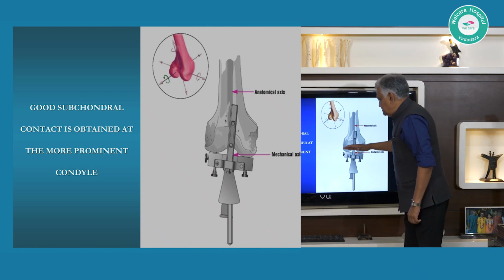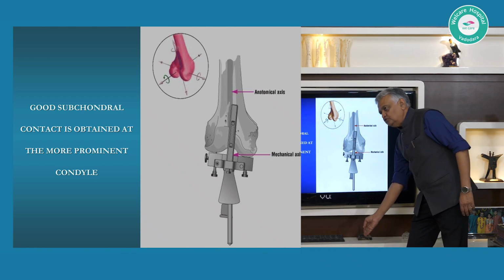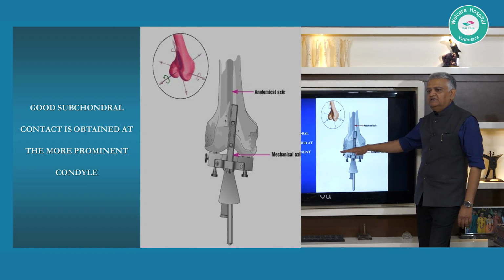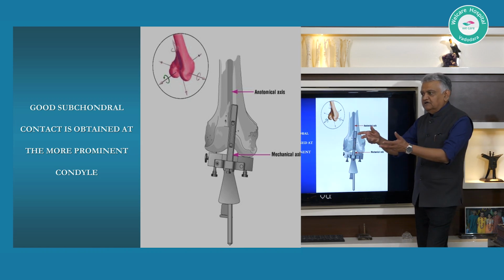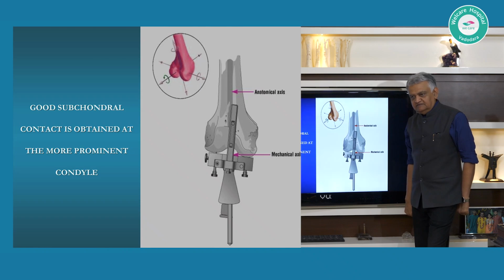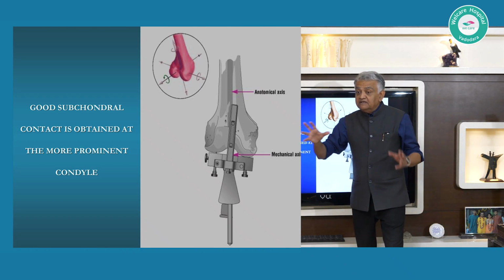Although at the end of the day, when you have finished your work, you will see the limb in neutral, and for all you know, your joint line will also be at exactly 90 degrees, which means neutral. So once the entire thing is over, you had no business using the word valgus in a true sense, because valgus means going outside from that middle line.